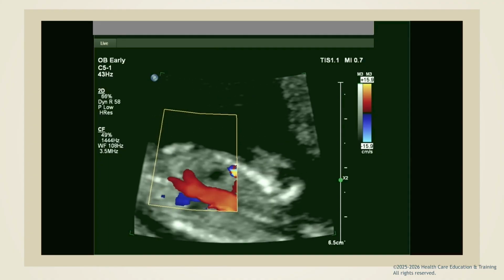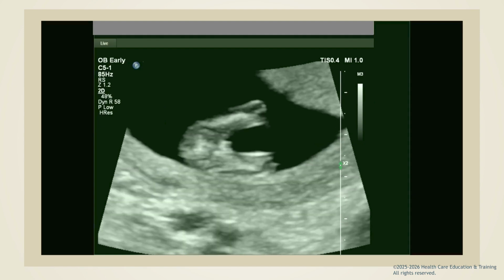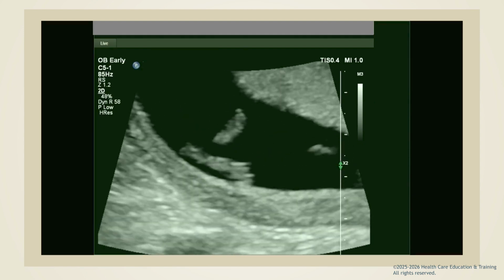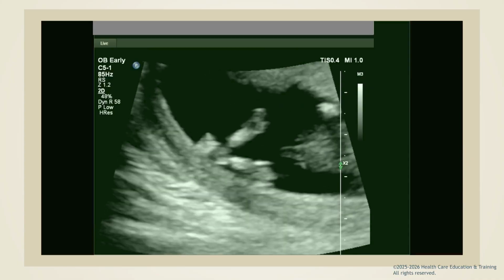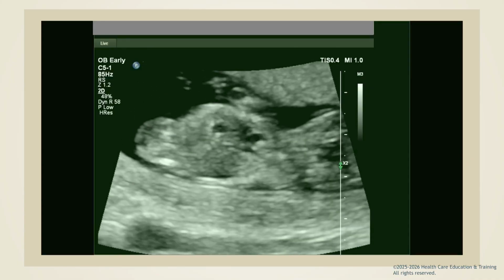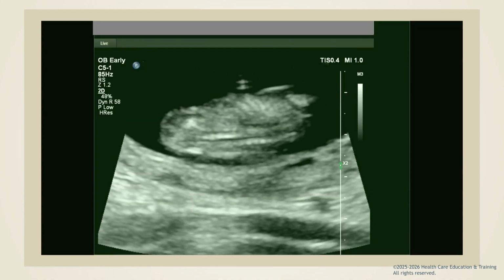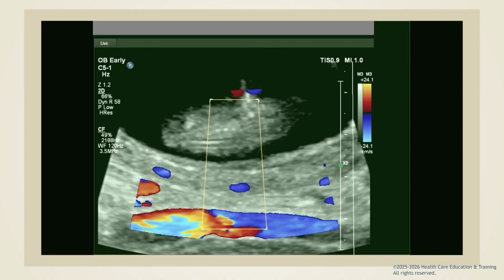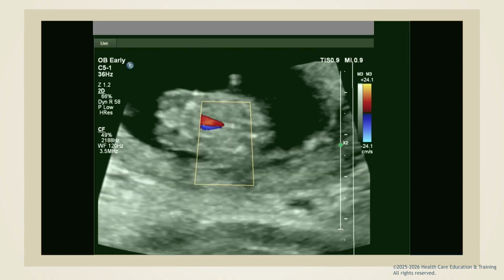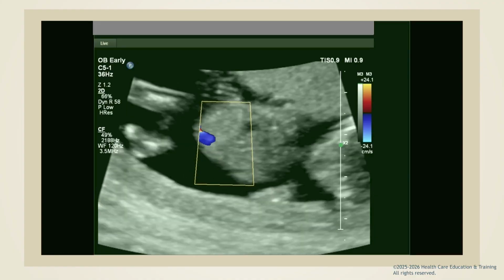In most pregnancies, an ultrasound is recommended around 20 weeks. This is called an anatomy scan. During this scan, a healthcare provider looks carefully at the fetus's development, measuring body parts and checking how the organs are growing and working. They may be able to see the brain, heart, spine, stomach, kidneys, bladder, and other structures. This scan can also help identify any concerns or differences in development that might need follow-up or care.